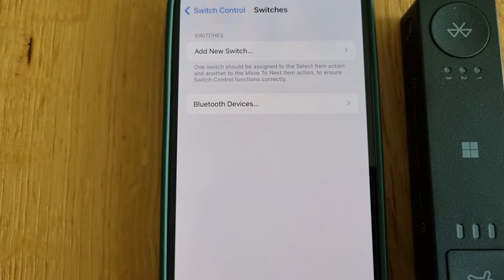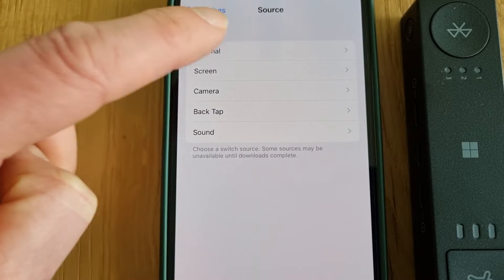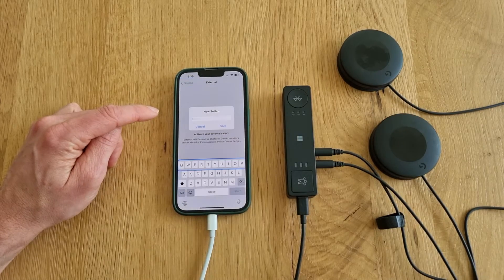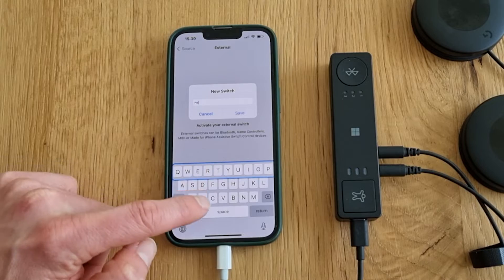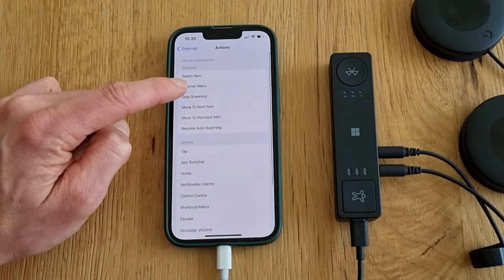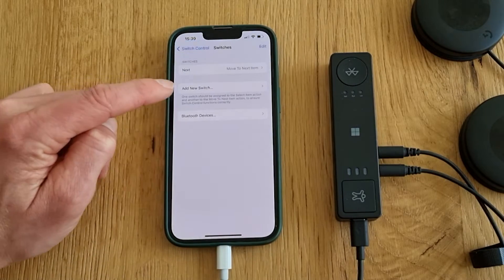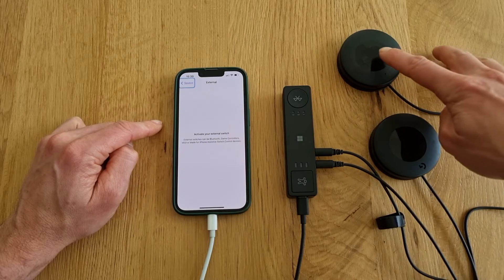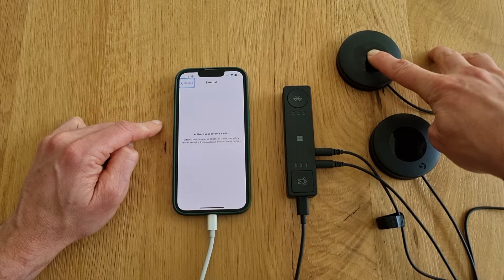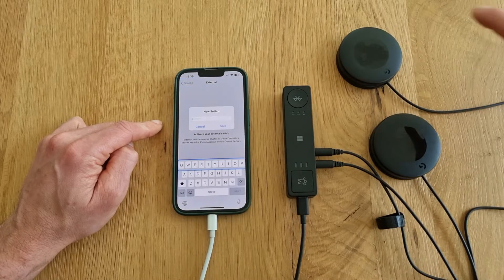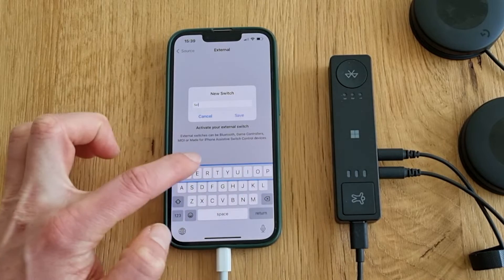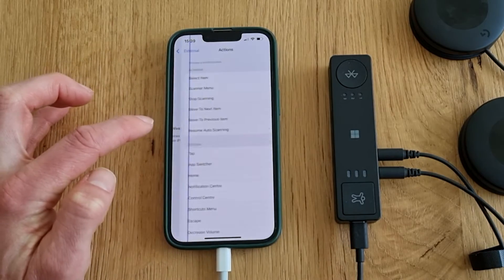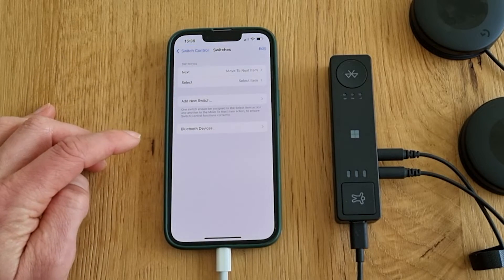Click on Switches, then Add New Switch, then External. Click the first switch and name it. Next, in this case, I'll set the Move to Next Item command to it. I'll then repeat these steps and add a long press functionality for the same button. Make sure to configure the long press in the Microsoft Accessories Center on your PC first, otherwise you'll get a button conflict. I'll go ahead and add Select Item to my long press.